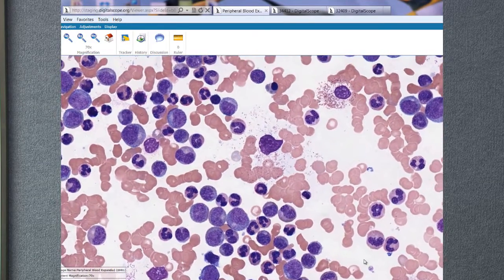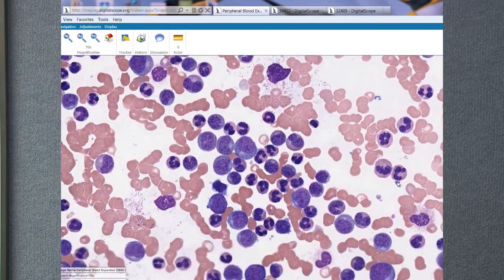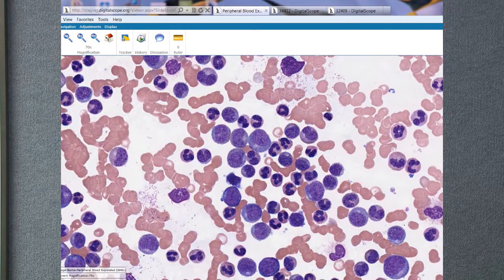And what they should have in their blood, they should have the red blood cells, and they should have these other cells. This is the same cell that we were looking at a while ago, but these are immature cells. They should not have these immature cells in their blood. And so you can see the difference in those two. This is abnormal blood that we see.